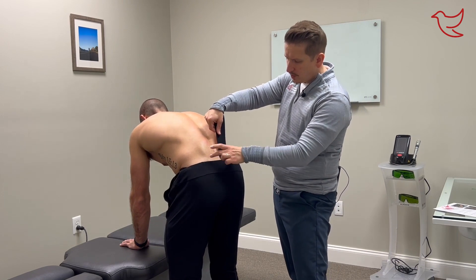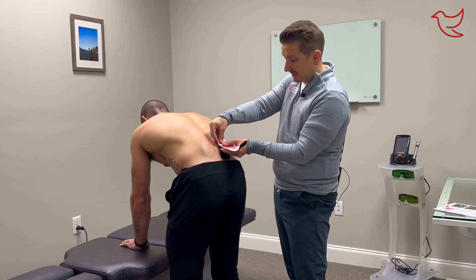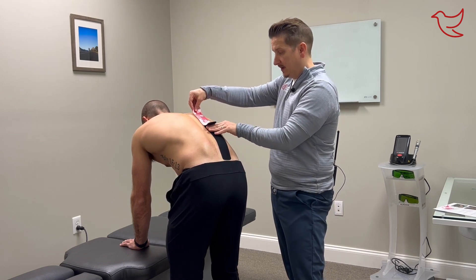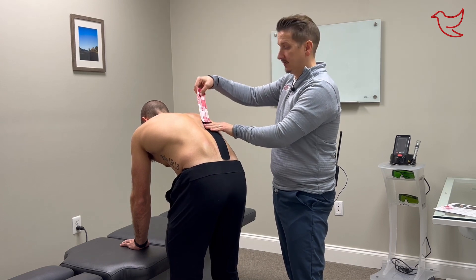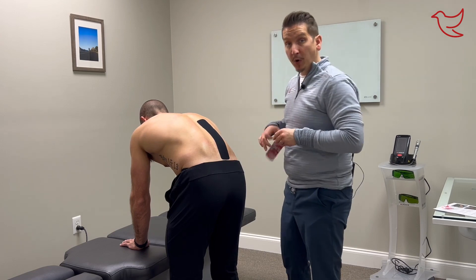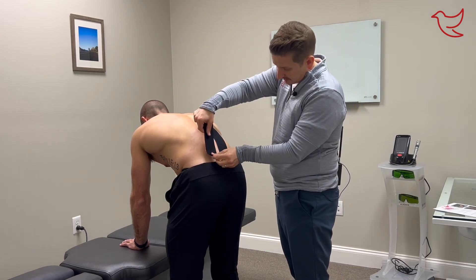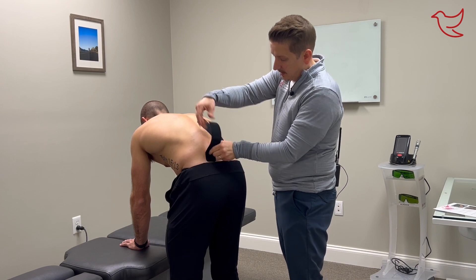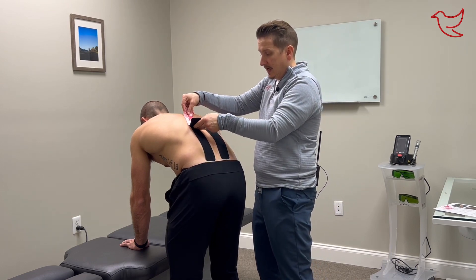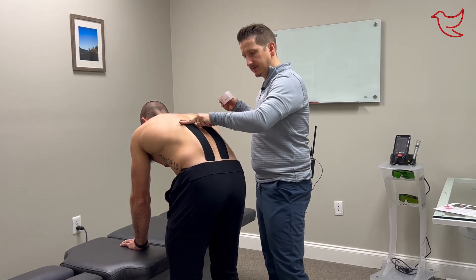We attach it down here over your SI joints on either side, then we apply a little bit of tension and roll it up your spine. With no tension we add the last little bit. We are going to do that on both sides of the lumbar spine — start right there over that SI joint again, apply a little bit of tension as we roll it up, stop the tension, and lay it nice and flat down.